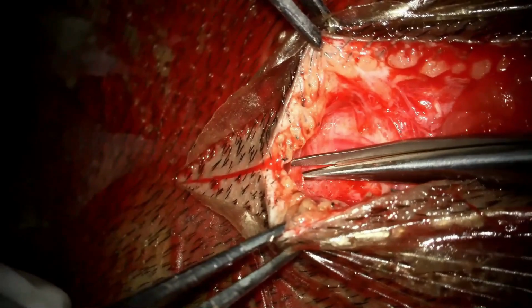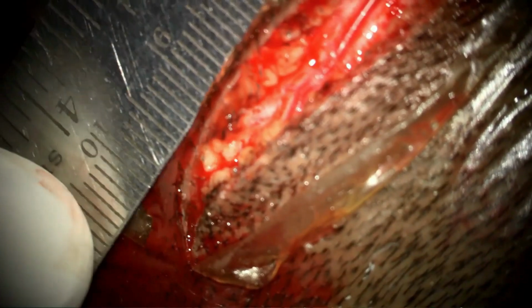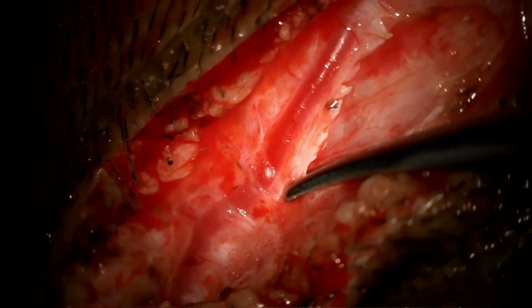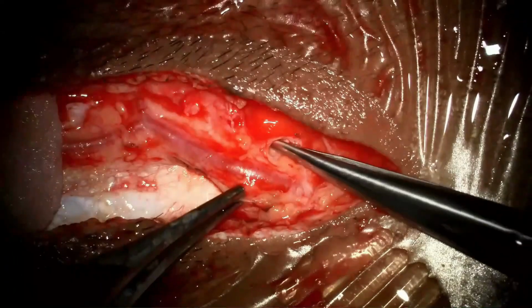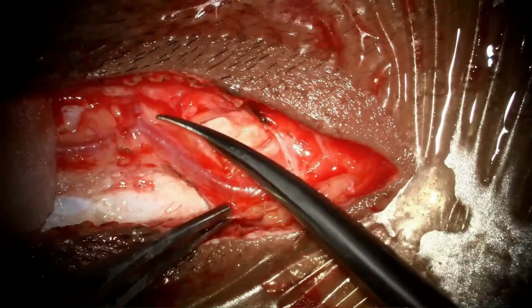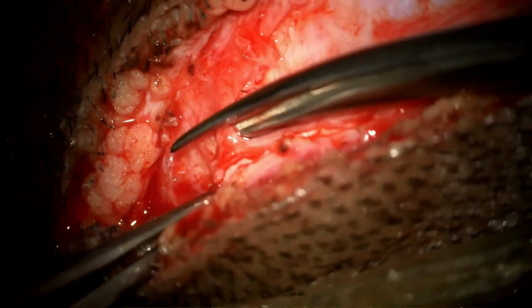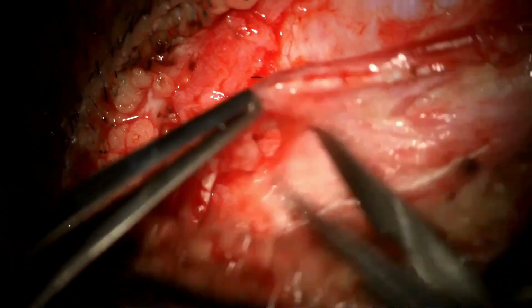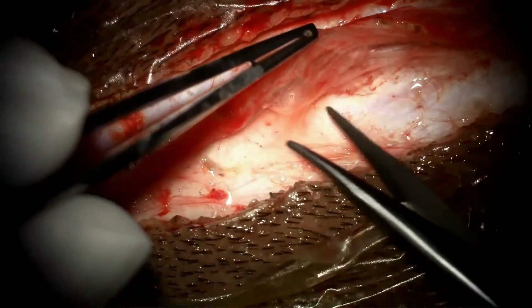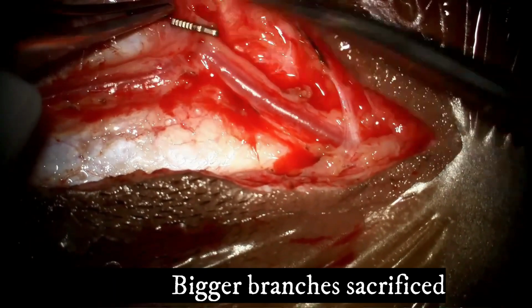The incision and superficial sharp dissection are extended along the length of the STA to expose about 10 centimeters of length. The STA is dissected with a loose tissue cuff on either side to mobilize it throughout its exposed length. The STA is also dissected off the loose areolar tissue underneath the artery. Any bigger branch is cauterized after applying a clip.